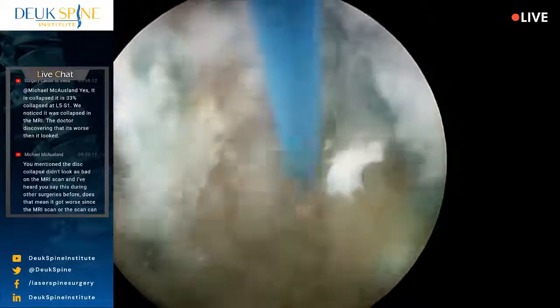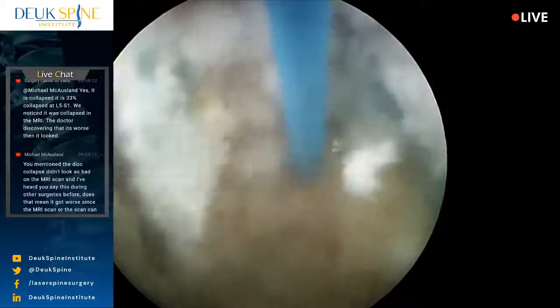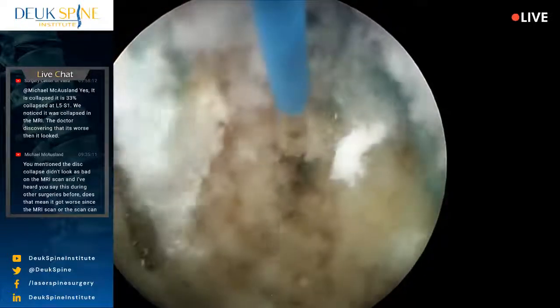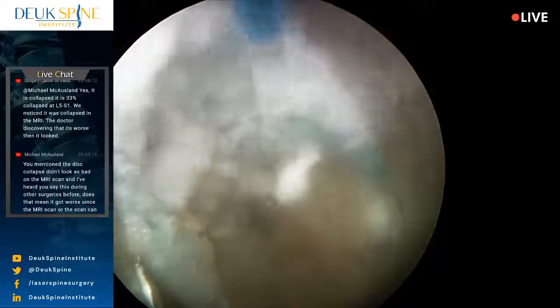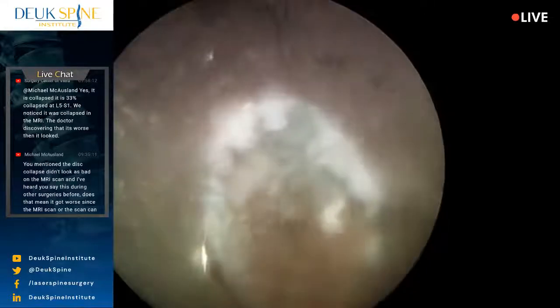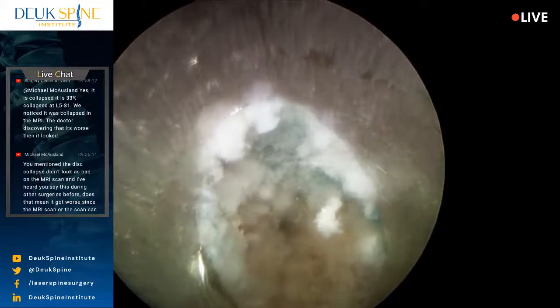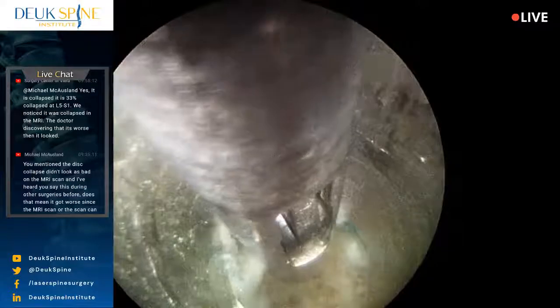All right, we're just about done at L5-S1. And I can tell you right now, there's no surgical instrument that would fit down this tube that would do this job that the laser has done. Let me have a grabber. Yes, sir. I'm going to try to get as much of this out as I can to give this patient the very best result possible.